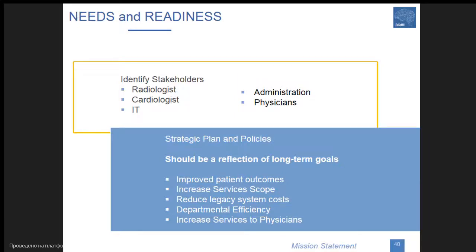You want to increase the scope of the services of radiology, to provide new diagnostic methods and new services, such as peer review of the images, or sending the images or SMS messages to the clinicians, remote access, and so on. With the remote access, of course, you can provide more flexibility for radiologists, for your staff, and create new services.